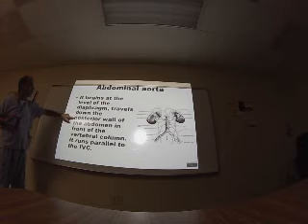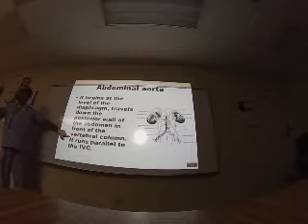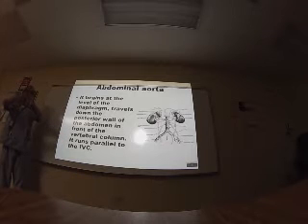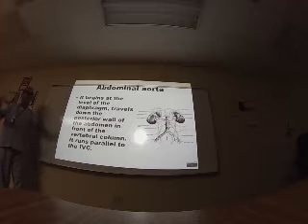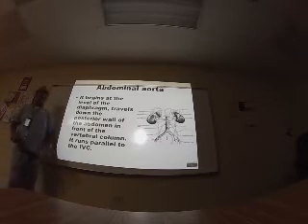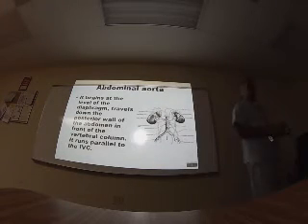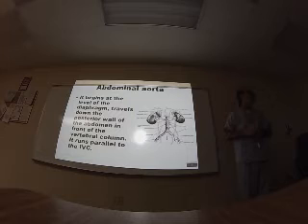It travels down the posterior wall of the abdomen in front of the vertebral column. This is very important. If you find the vertebral column, you can see the aorta. Our landmarks are together: always aorta and vertebral column are together. Aorta anterior, vertebral column posterior. How do you see the vertebral column? Like a big shadow, because it's bone and very, very posterior.